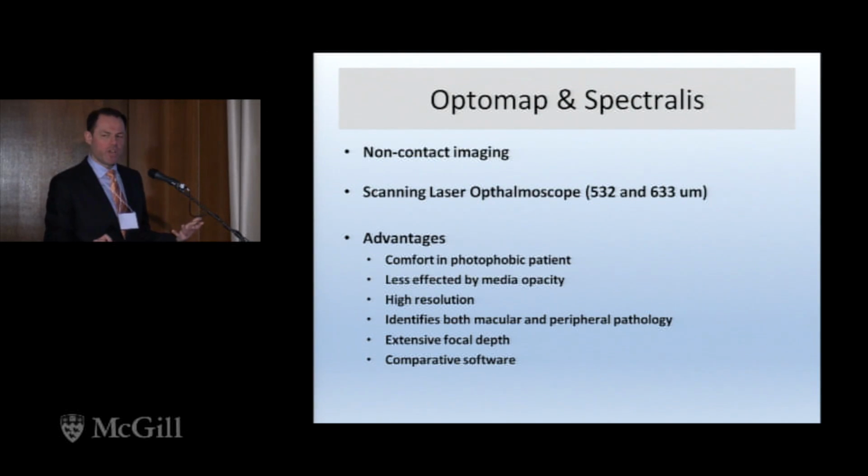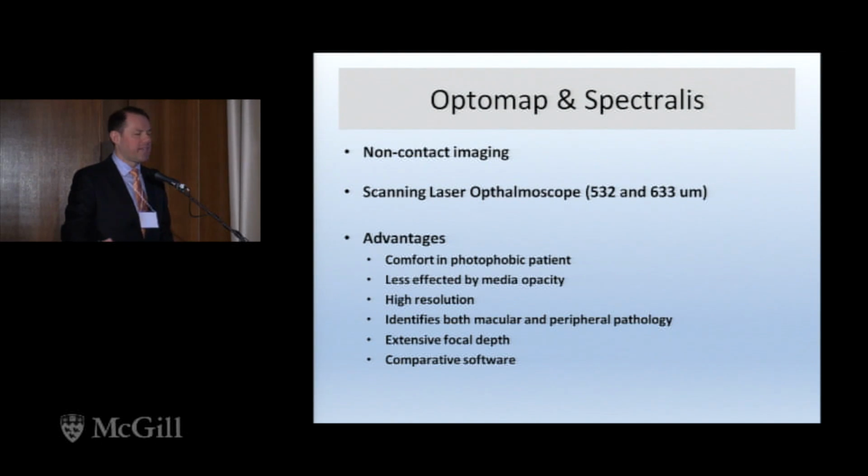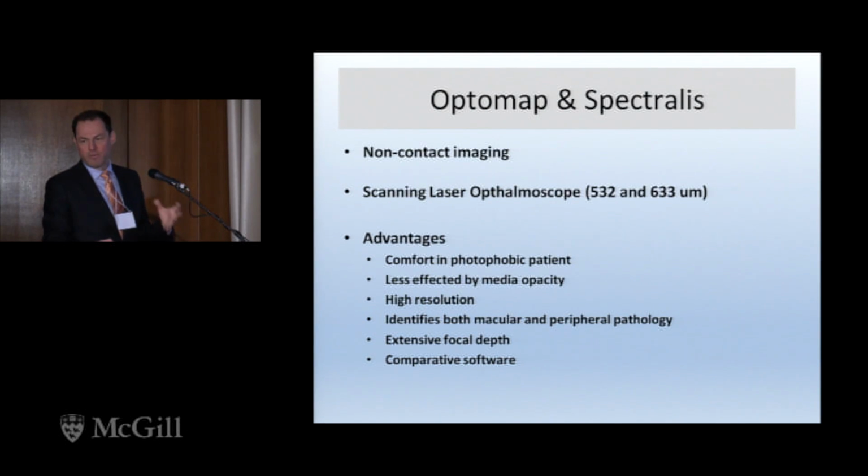So as I mentioned, these are non-contact imaging. We don't have to put a lens on the eye, and it's not really photography. We use SLO laser, which can use different wavelengths of laser. And the advantage is we're not using a bright light to illuminate the fundus, so it's more comfortable for photophobic patients.